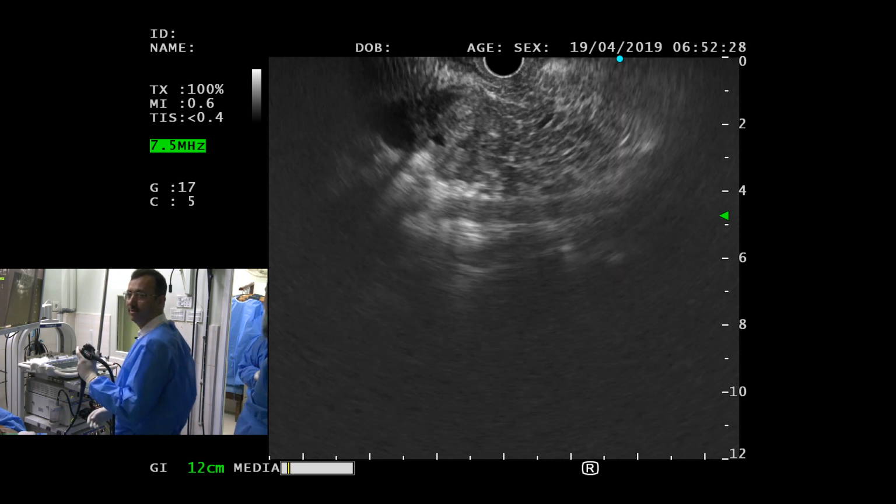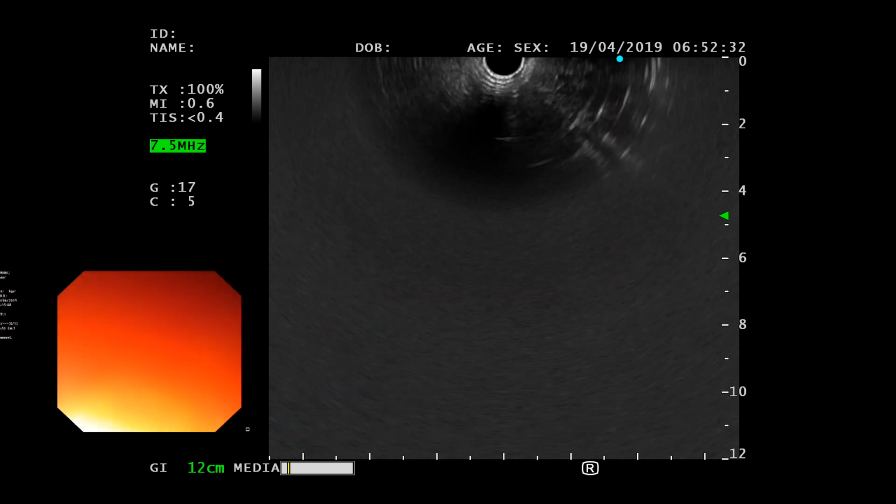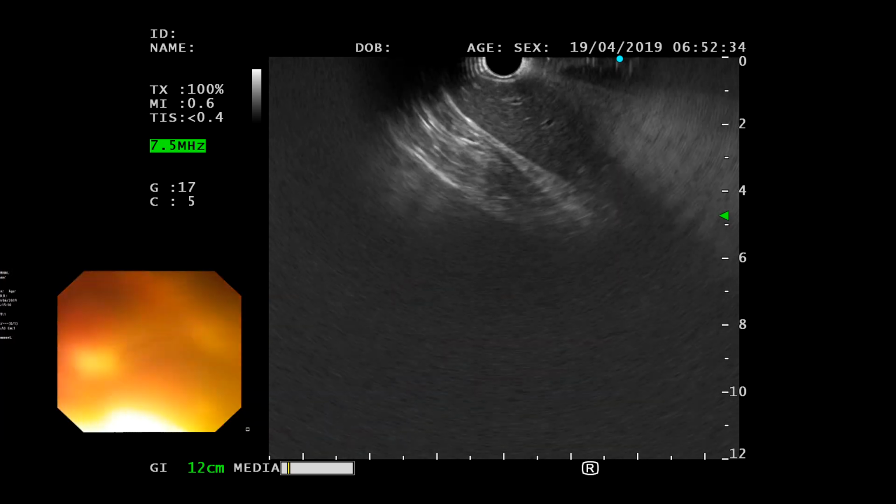Can you show us the lymph nodes again, please? Okay. I shall show the lymph nodes again.